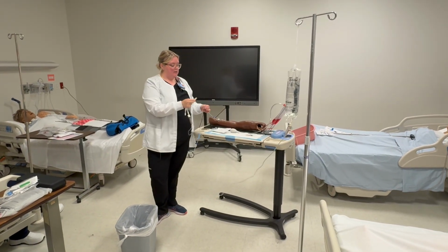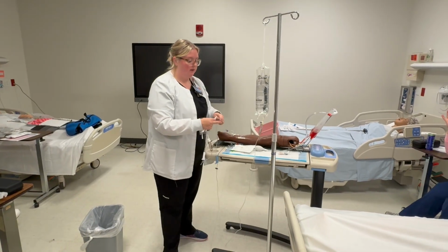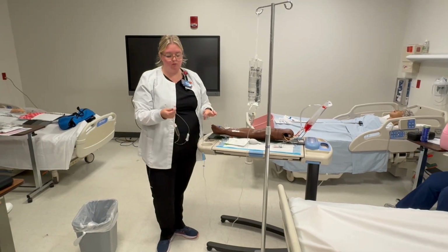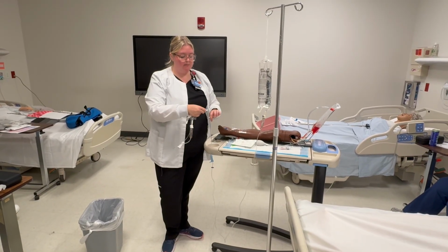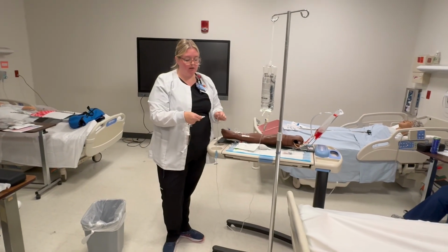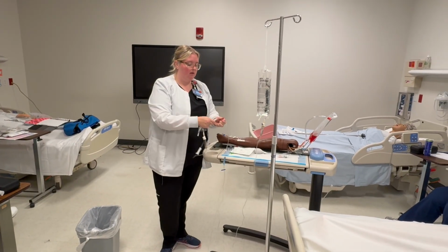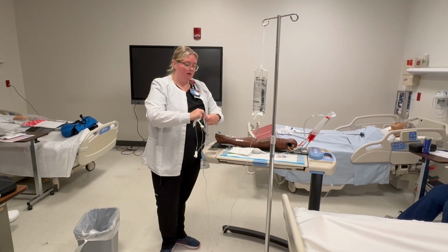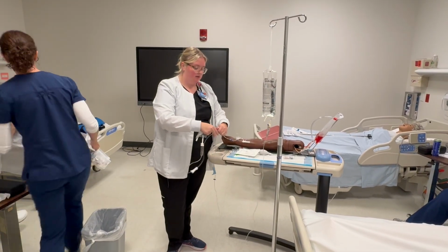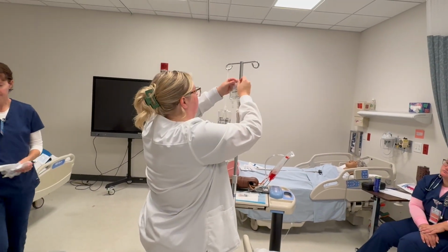Can I connect these? No. What do I need to do first? Alcohol. Yep. So I'm gonna alcohol, and this again is where you have to work and see what works best for you. This is what works best for me. I'm alcoholing and I'm looking at this so that it stays clean, and I'm taking this cap off in a way where I can see both and I'm not contaminating. Push, twist. Okay? We're gonna hang this up. Oh no, we're not gonna hang it up.